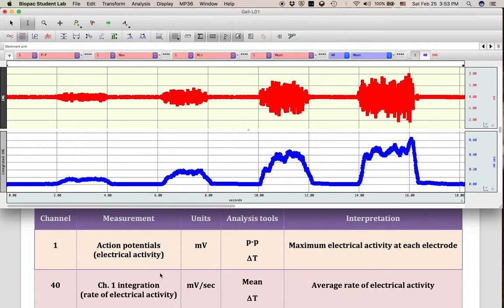Channel 40 takes the raw data found in channel 1, converts everything to absolute value because we don't have subtracted electrical activity from existence. It is happening, so it is positive, and it's going to make it a rate by saying how many millivolts in a given amount of time, I believe it's 0.1 seconds, are occurring. We get values that are only positive here.